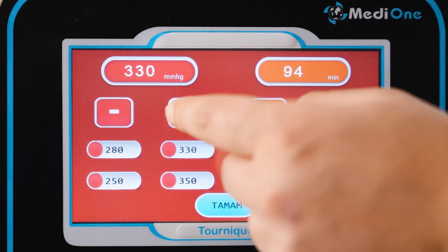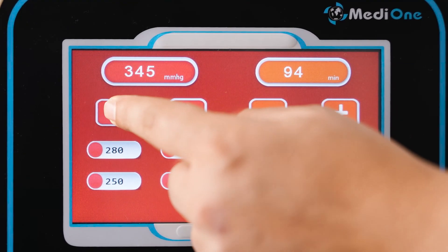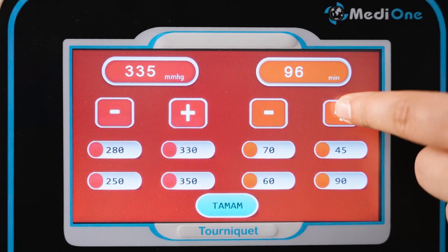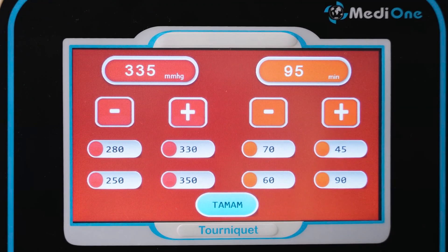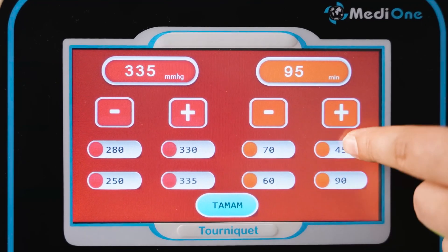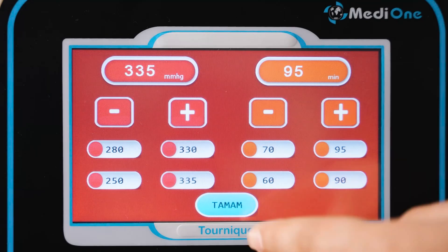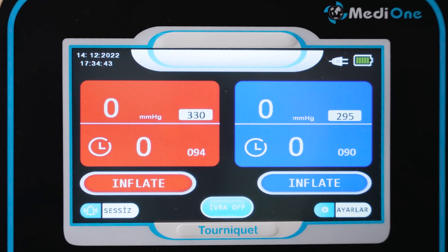There is a pressure gauge at the top of the screen and a time gauge at the bottom. The pressure range is between 20 and 650 mmHg, with increments of 5 mmHg. The time range is between 2 and 240 minutes. There are four separate recording buttons for both settings. You can save the values you want by pressing the icons for about 5 seconds. Your values are saved each time the device is turned on. After entering the values you want to set, press the OK icon. The same procedures are valid for the distal section.